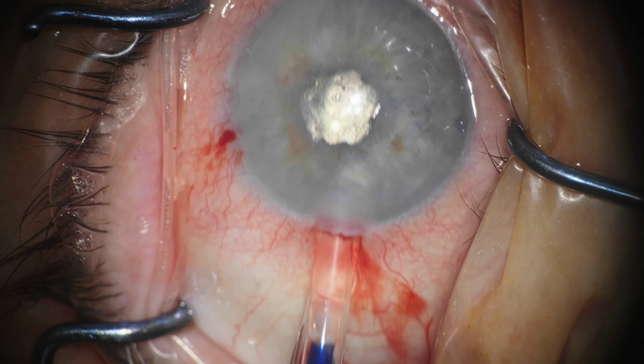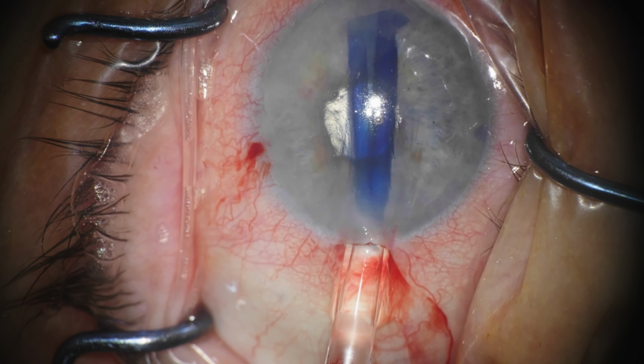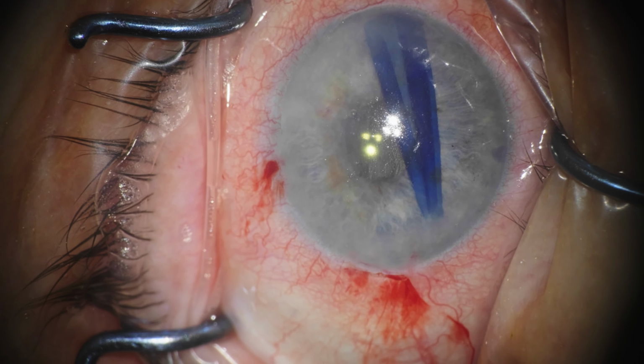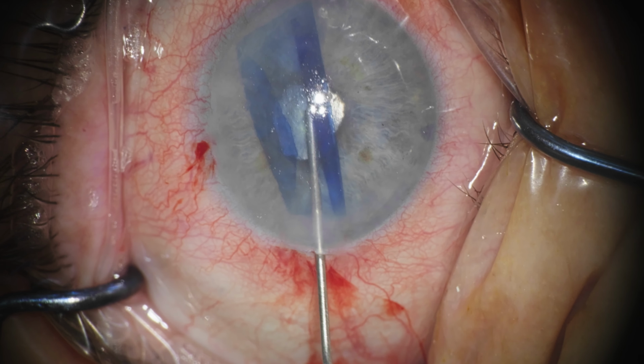then we proceed with injection of the graft. This time the incision is smaller than we usually do it, and the graft wants to pop out. But we win with forceful injection of PSS and have the graft land in the angle. Now, because there's no pressure in the AC, we can use the main wound.